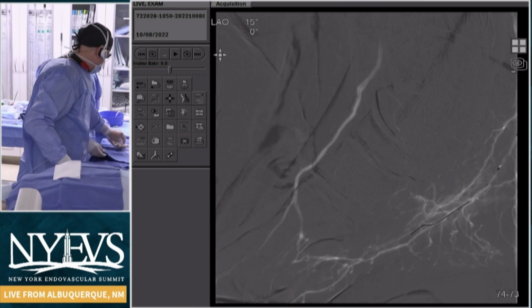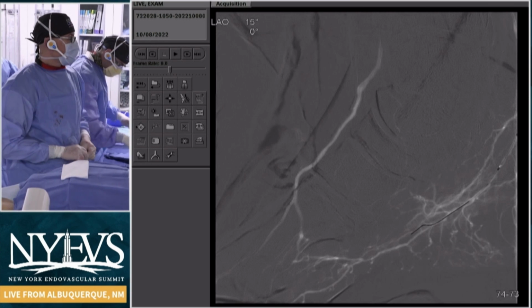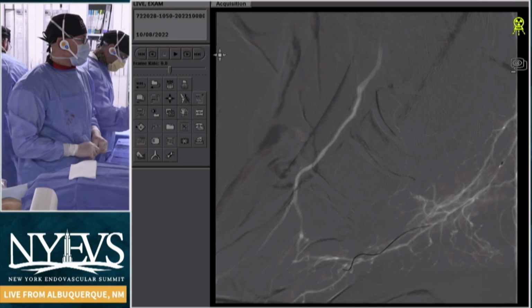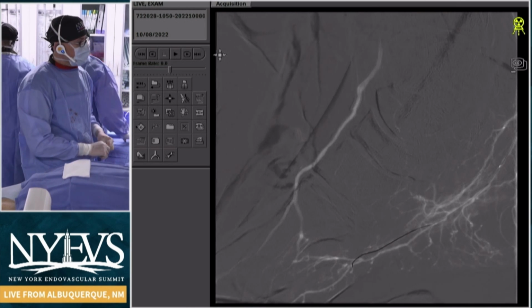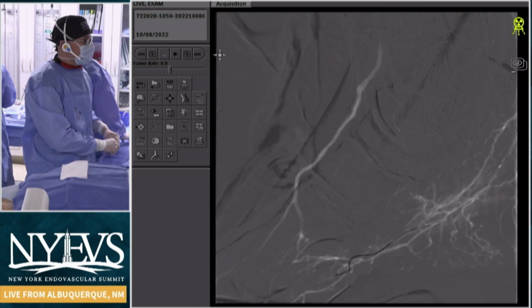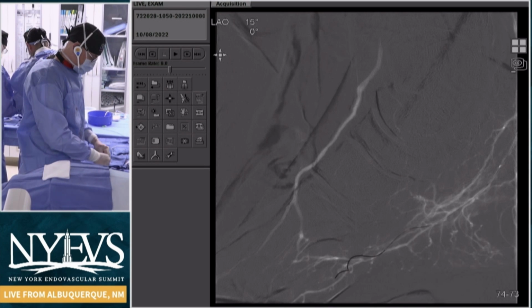I'm wondering, the microstent looks like it has a lot of promise. Does it preserve those collaterals? Let's say in the proximal anterior tibial, that collateral that comes off laterally and goes up to the geniculate. Whenever you put a coronary stent there, it almost always preserves that collateral, even when the vessel goes down distal to that. Does the microstent, because of its characteristics, actually preserve those collaterals, or does it close those off? Yeah, definitely yes.